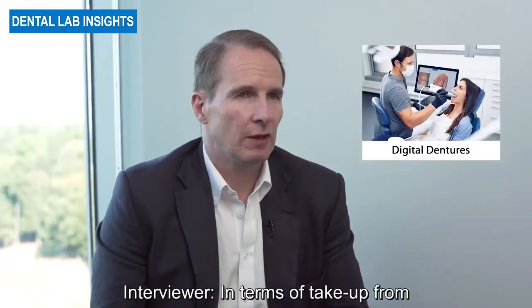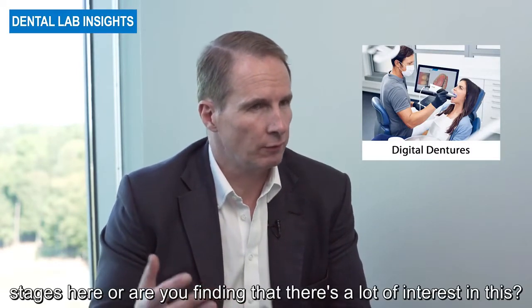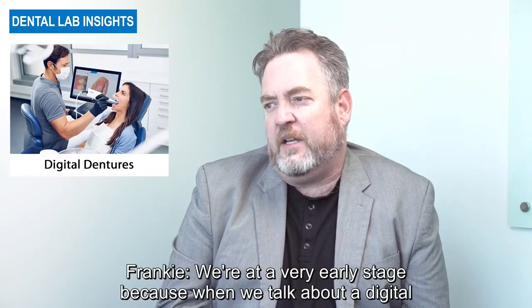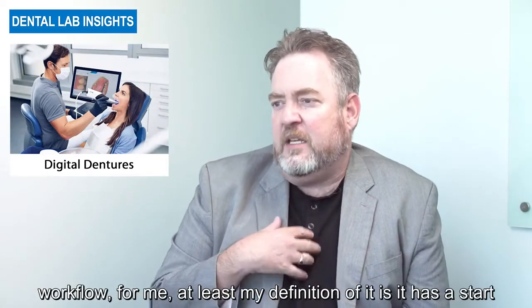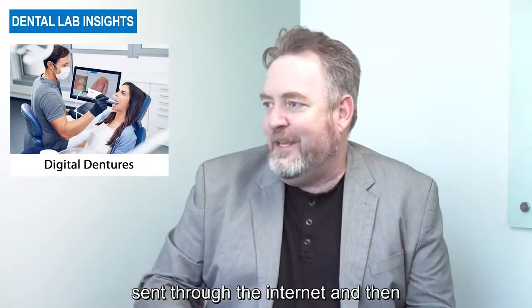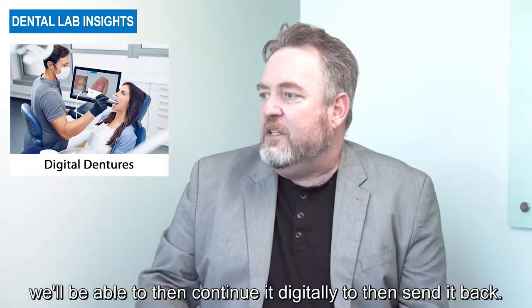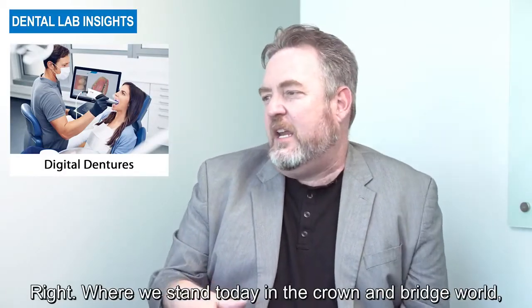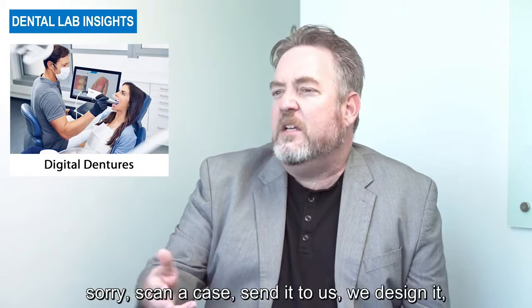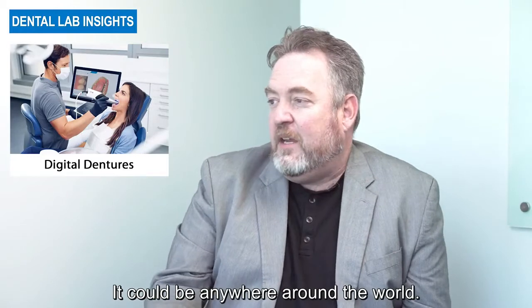And in terms of take-up from dentists, are we at the early stages here, or is there a lot of interest? We're at a very early stage, because my definition of a digital workflow is that it has to start digital from the doctor, sent through the internet, and then continue digitally to be sent back. Where we stand today in crown and bridge, I have doctors who scan a case, send it to us, we design it, we send it back, and they mill it chairside. It could be anywhere around the world.